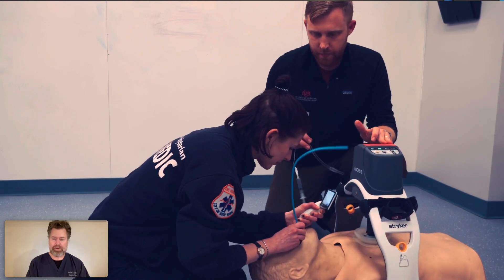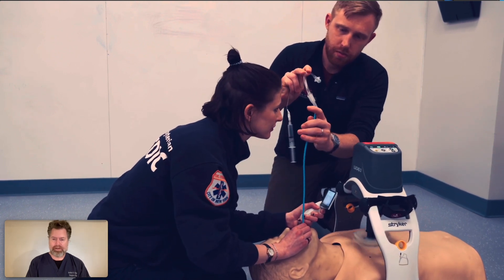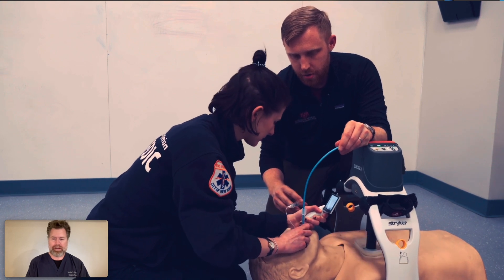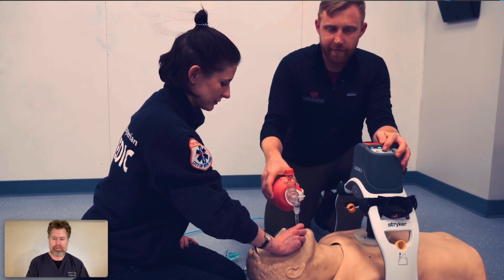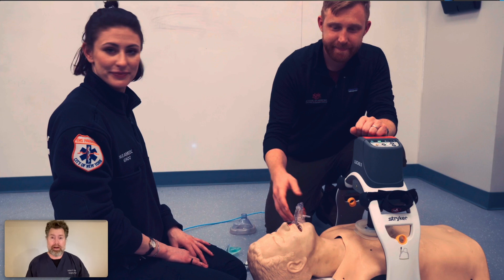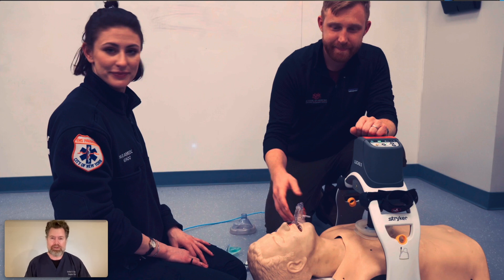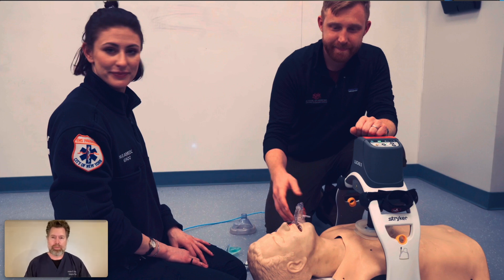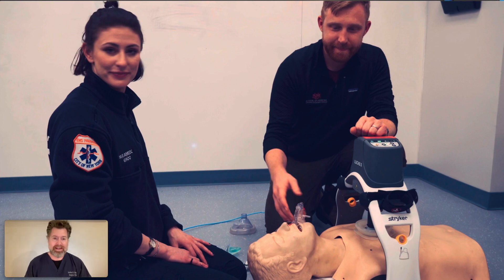She was able to get good visualization there. She had to twist a little to get the bougie past the glottic opening — railroading that tube over the bougie, inflating the cuff, removing the bougie. She used a bougie, which is great in this situation because it allows her to focus on getting tracheal access without trying to get the tube in simultaneously. Once she has the bougie in the right place using a video laryngoscope, she's able to simply railroad the tube over — and that probably took less than 30 seconds.